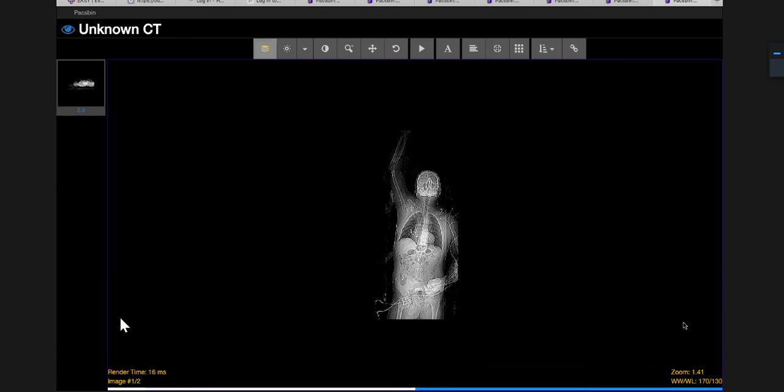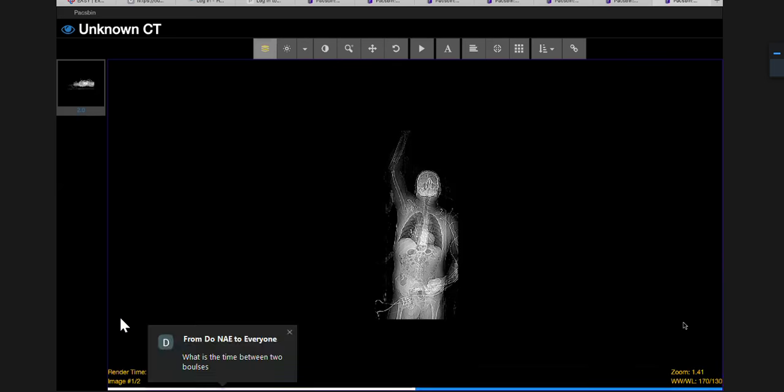Now, when we just do a normal CT chest, say in an outpatient setting, how is the patient looking to you?